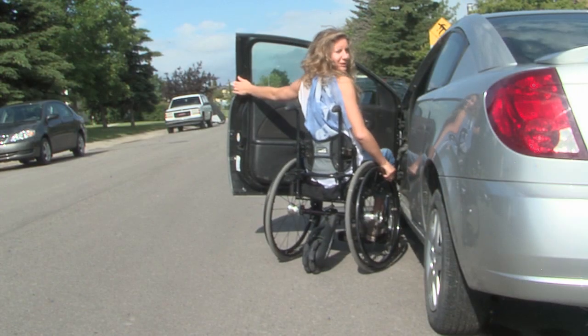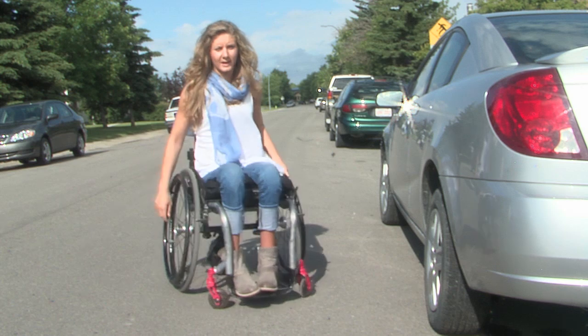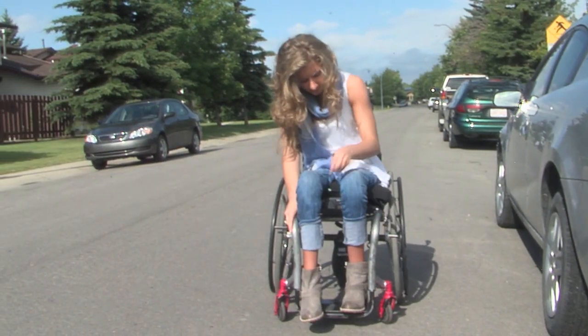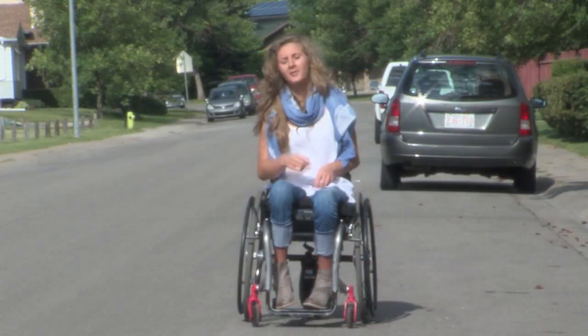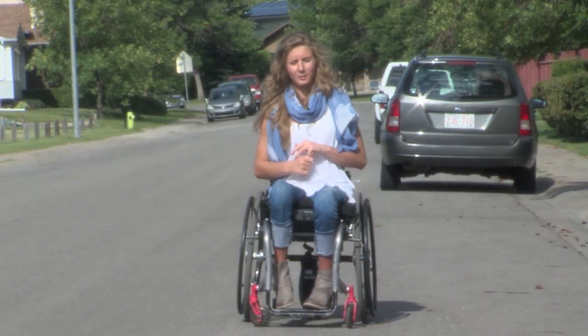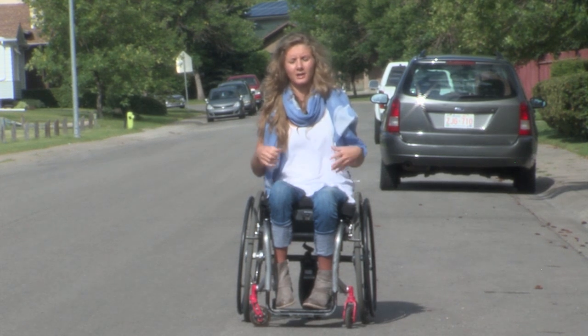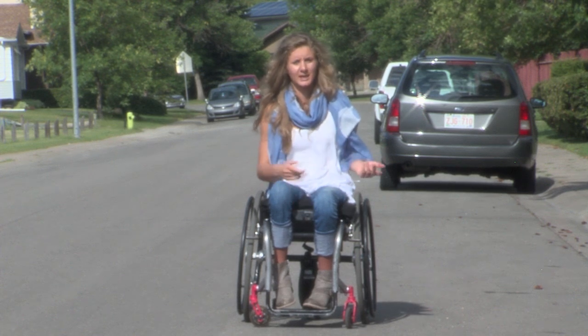Now I'm in my wheelchair and I'm ready to go. The next step is turning it on — there's a little button right here on the battery pack. The cool thing about this is you can pick the speed you want to roll. If you push on your side guard or your hand rims you can set the speed, or it also comes with preset speeds.